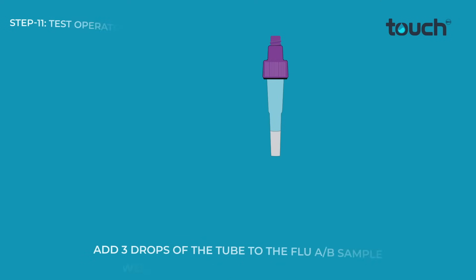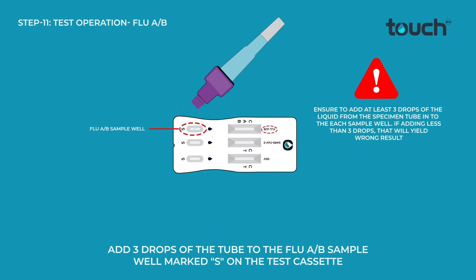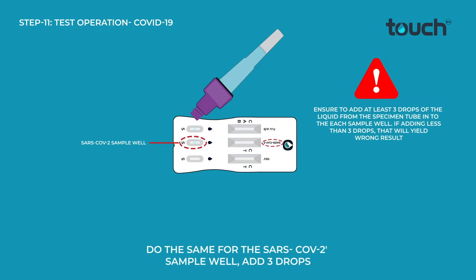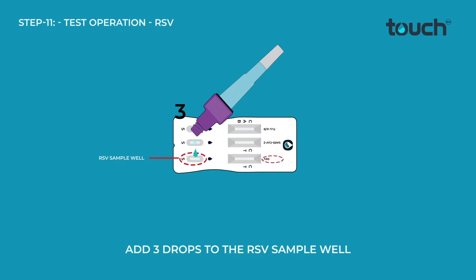Add 3 drops of the tube to the Flu A/B sample well marked S on the test cassette. Do the same for the SARS-CoV-2 sample well — add 3 drops — and add 3 drops to the RSV sample well.